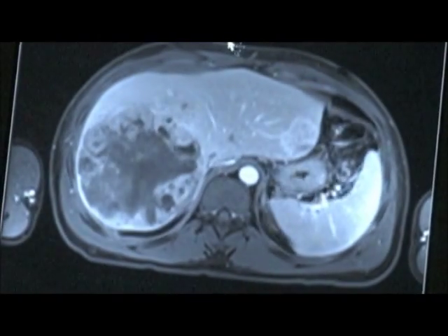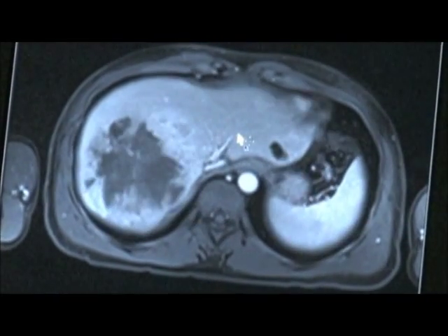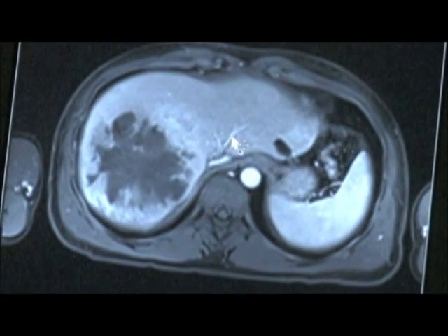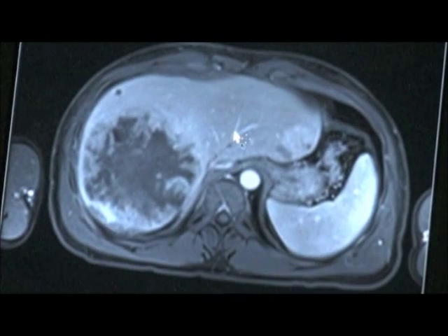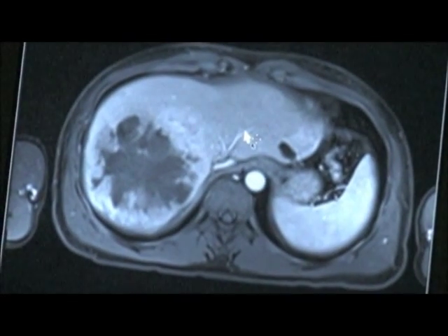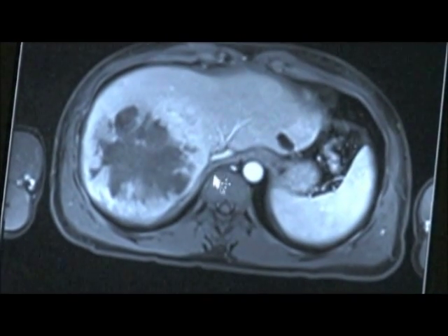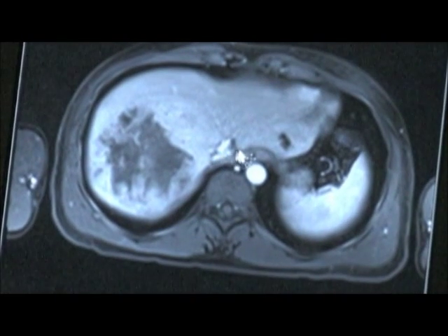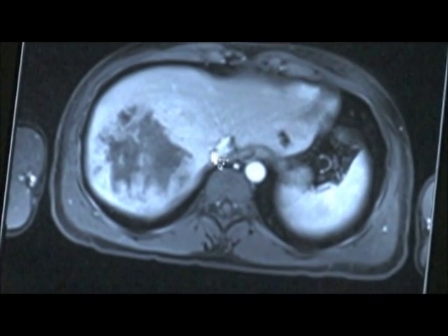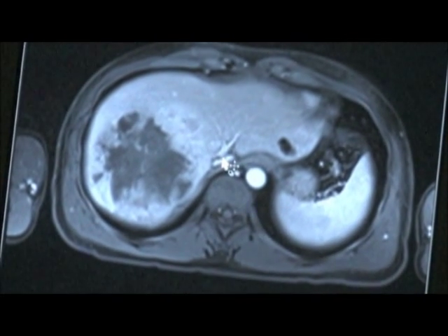The next phase we call early hepatic venous, oftentimes referred to as portal venous phase, but in these images we generally see contrast in the hepatic vein, so that's why I think it's more appropriate to call it early hepatic venous. What you also notice when you look at the IVC looks funny, and we see small little black dots around it. Well, this is a transplant liver.